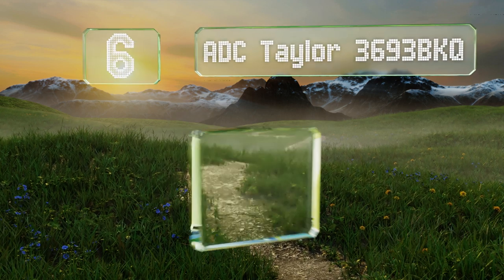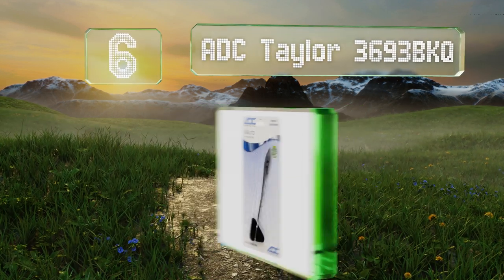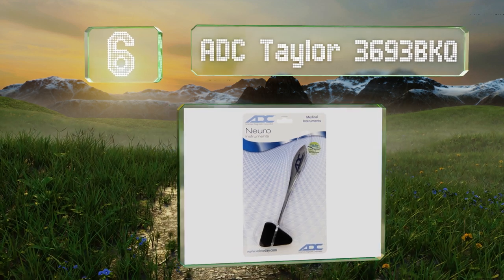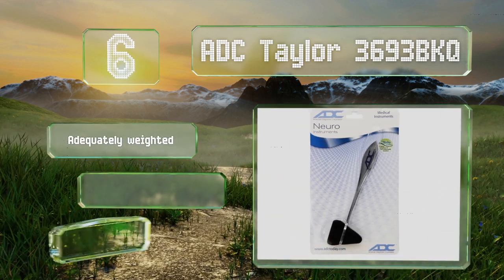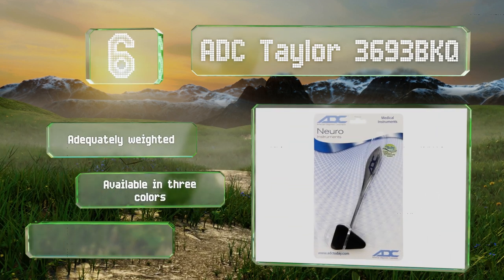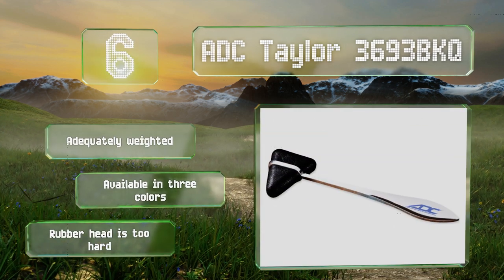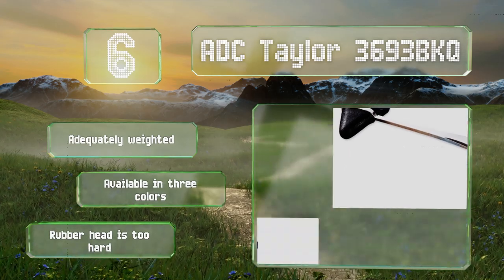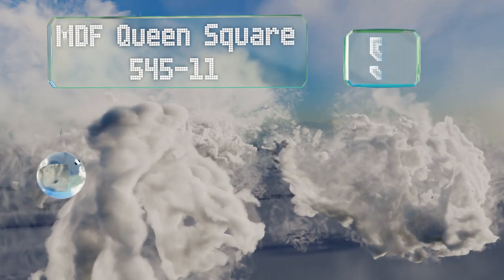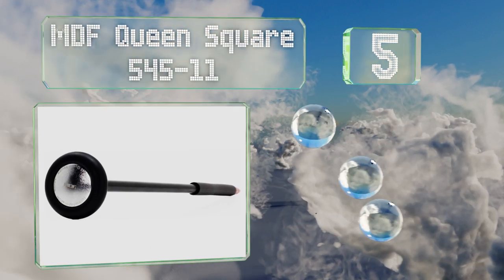Moving up our list to number six, while it isn't the highest quality or most feature-packed model, the ADC Taylor 3693 bkq is available for a rock bottom price that makes it ideal for medical students. There's no reason it shouldn't serve them reliably until they graduate. It's adequately weighted and available in three colors; however, its rubber head is too hard.